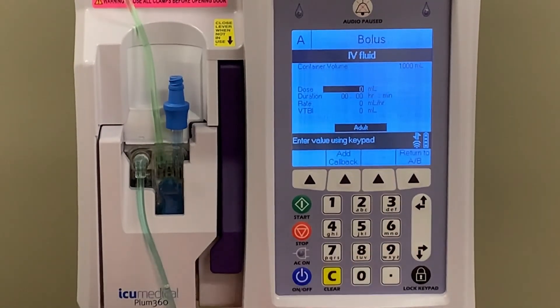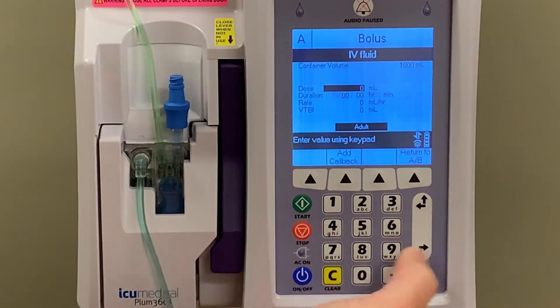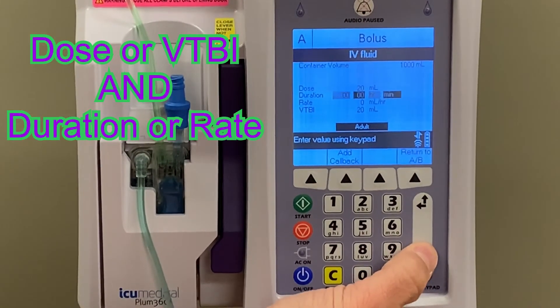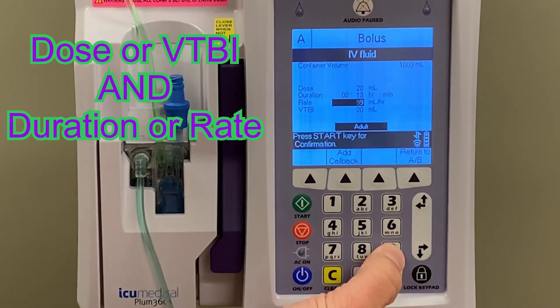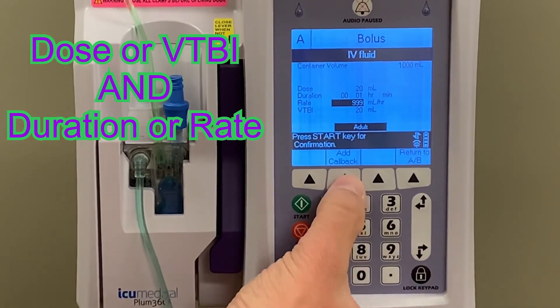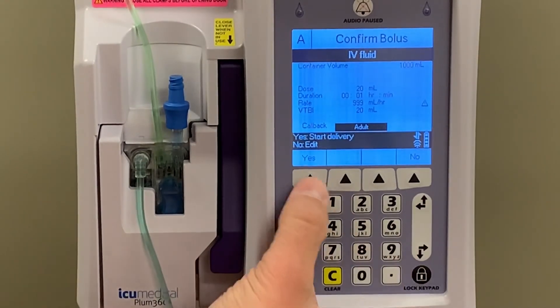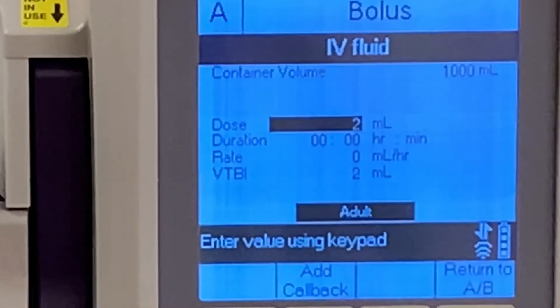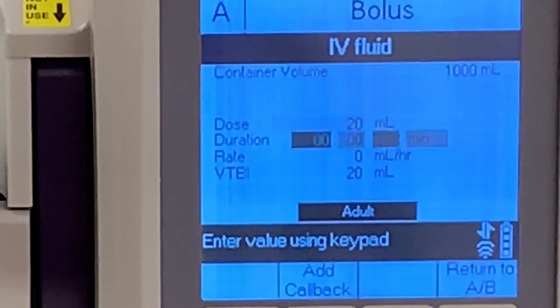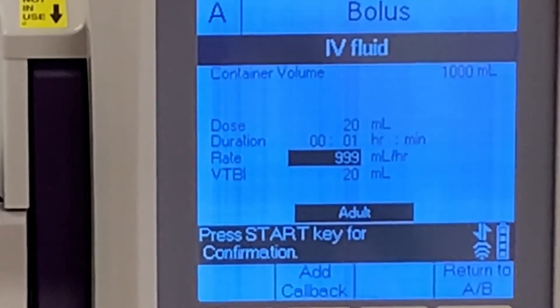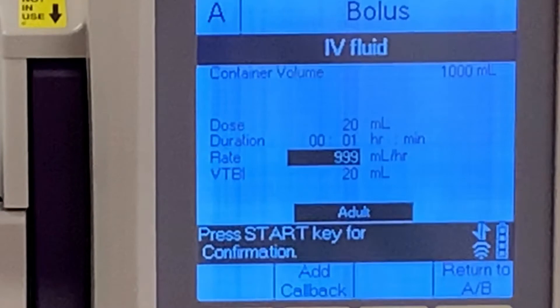When we push the bolus key, we are taken to a bolus programming screen. You need to enter two out of the four fields to program a bolus: either the dose or volume to be infused, and either the duration or rate. When you fill in two of the required fields, the other two will autofill to complete your program. For this example, we will enter a dose of 20 milliliters at a rate of 999 milliliters per hour. You'll notice the duration autofilled for one minute, and the volume to be infused at 20 milliliters.